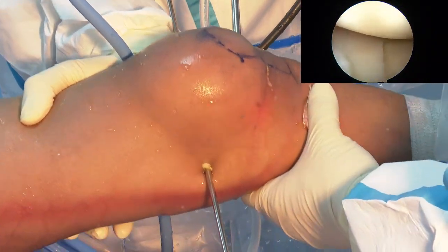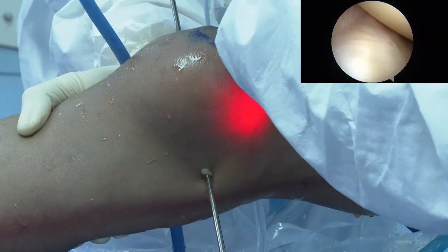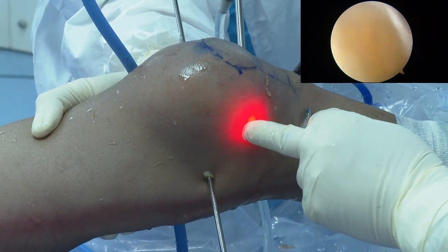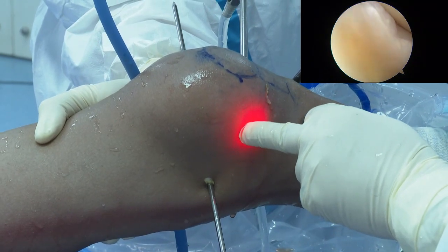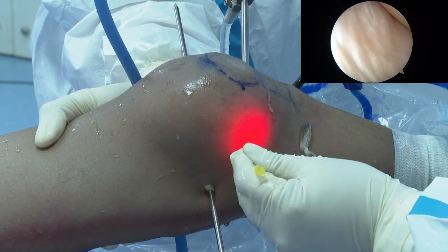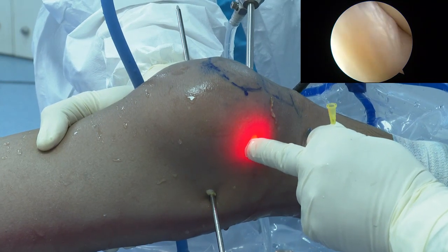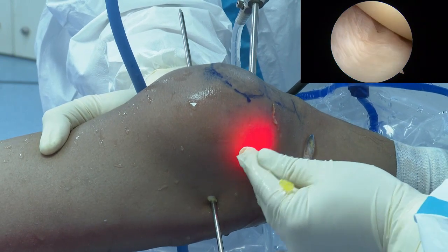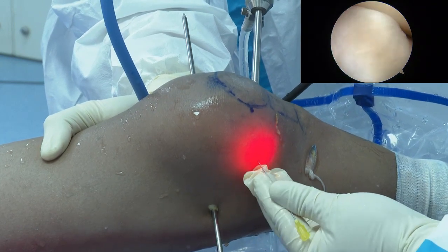So, bend the knee a little bit. Okay. So you see this? This is what we call the mid medial portal. Okay. So from here, 现在通道的地方就是内侧中线通道。From here, we will use one portal for the meniscus root surgery. Okay, put your finger. 我们需要这个内侧中线通道来做根部修补。Okay, we call this the mid-medial portal, just above the meniscus.